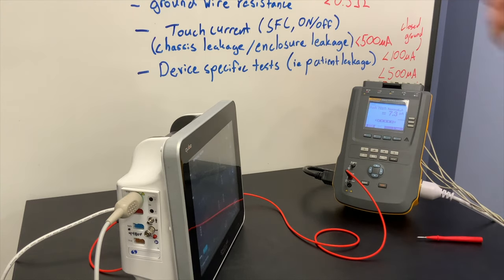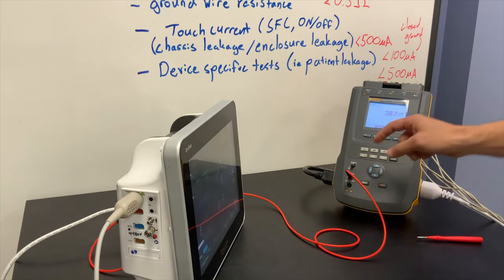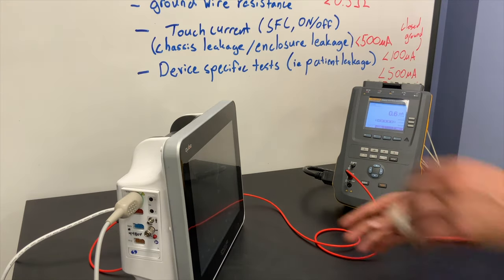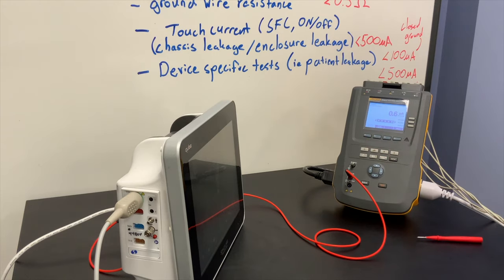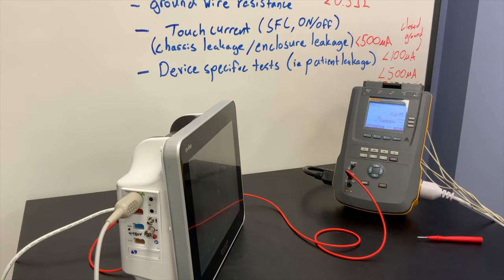But that lead isolation test is not required in NFPA 99 — I'm just showing it as a side note. Now I'm going to go to my lead-to-lead leakage. To do that, I go back and hit lead to lead.